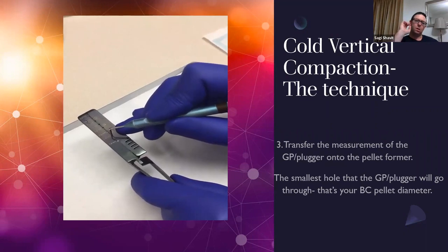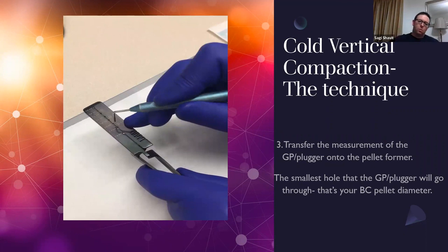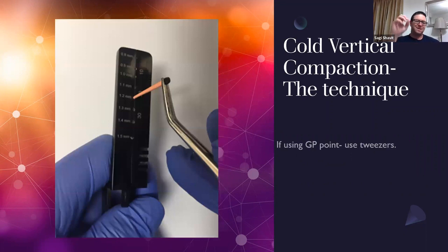So now I know that the plugger in this case has a diameter of 1.4 or 140, and I take a note of that. If I'm using a GP point, the same thing. For GP points, I would recommend using tweezers and not fingers. They're just in this manner. Basically, you create your own flexible plugger. In this case, the diameter of the plugger is 1.2 or 120.